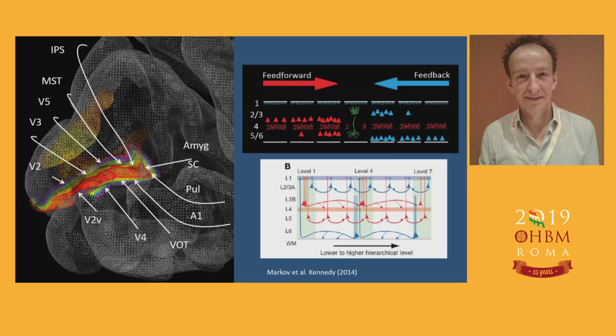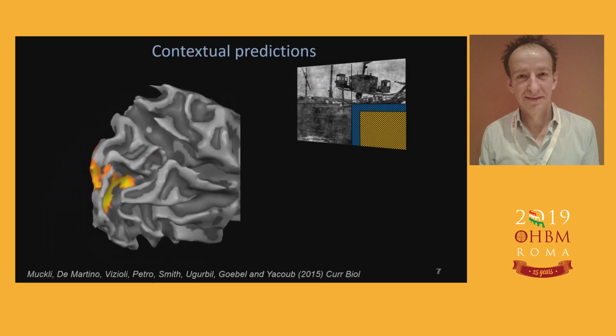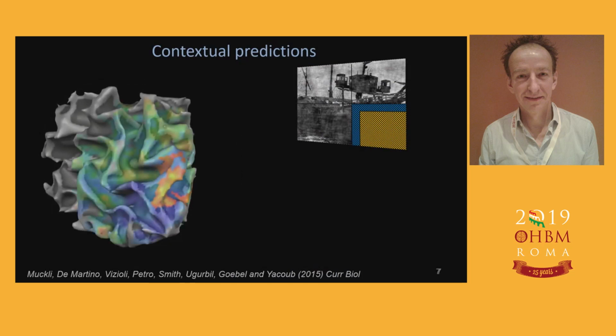So there's the hope with increasing high-resolution fMRI to 0.8 millimeter isovoxel, for example, or below-millimeter voxel resolution, that we can tune into the different messages. Now it's an empirical question how well that works. So I'll show you one of our first studies. This data is from Minneapolis, and it triggered this line of research in collaboration with Federico De Martino, Rainer Goebel, and Essa Yacoub, and many others.